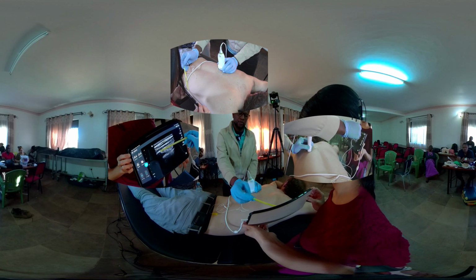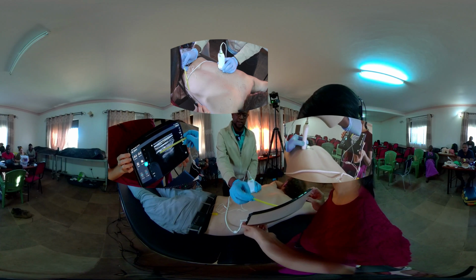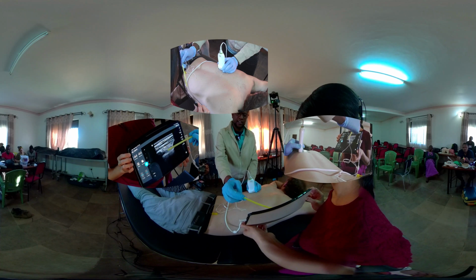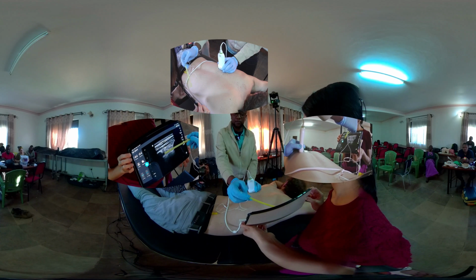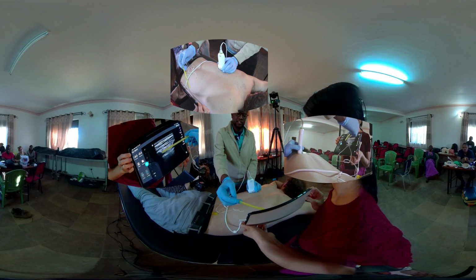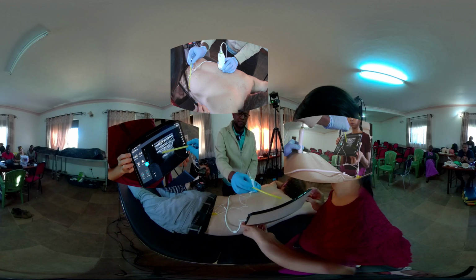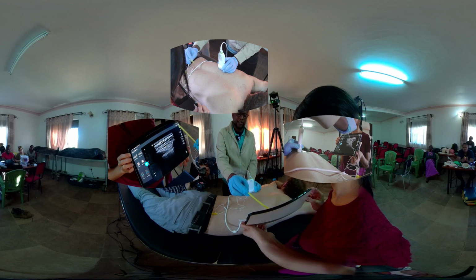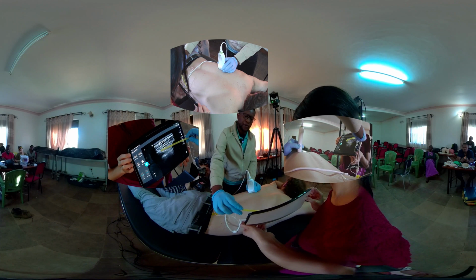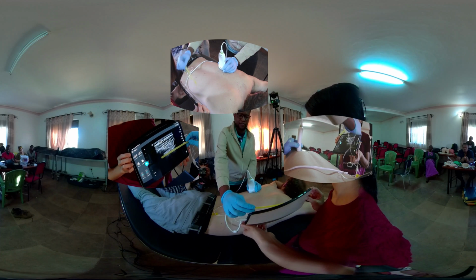Some people will aim for the bony transverse process, but others will say you get more efficacy by depositing it in the soft tissue. So I like to deposit my local somewhere around there, and you see it spread and separate the erector spinae muscle away from the transverse process.